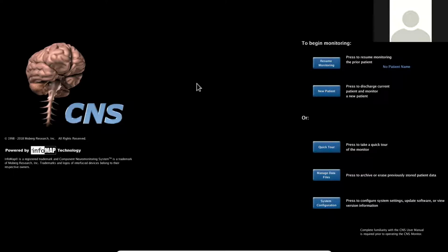So I'm hoping everybody can see the CNS Monitor homepage screen. I had gathered some data previously, and then I shut down the monitor without discharging the patient. We don't recommend that you do that, but I wanted to show you what it looked like if that in fact happened. If someone doesn't discharge their patient and then the CNS monitor gets fired up again, whether it's been an hour later or a week later or a month later, it still holds that data active. And it says, I seem to think that you were monitoring a particular patient. Do you want to continue doing that?